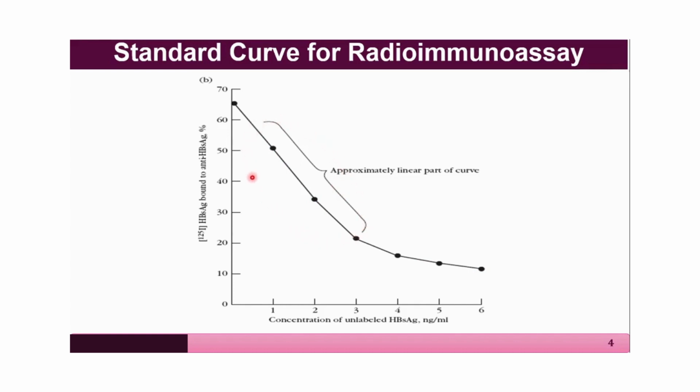for finding out the antigen concentration in the unknown serum sample, which is suspected to have the antigen.